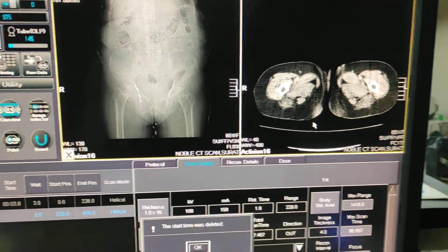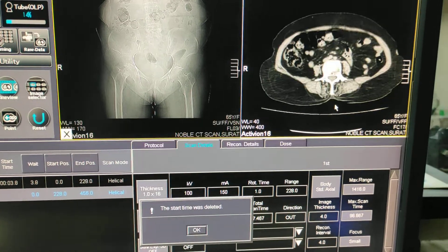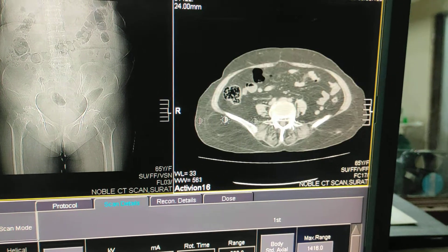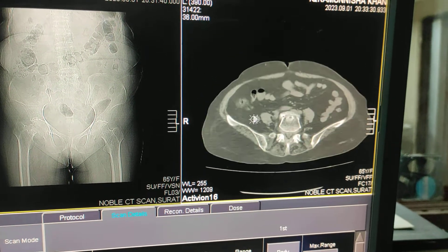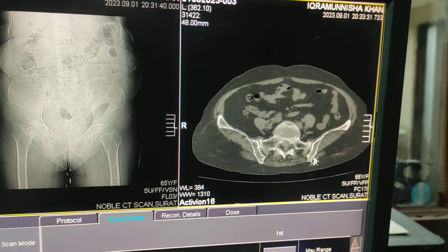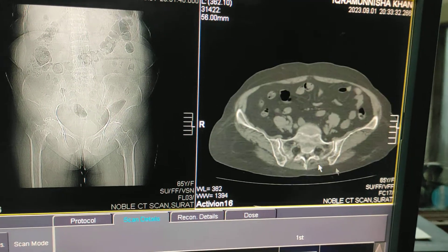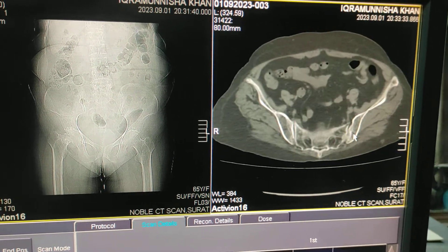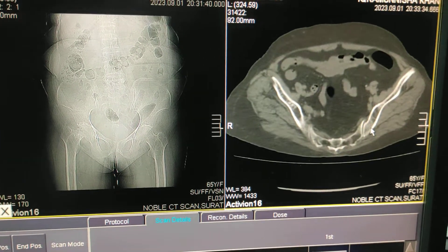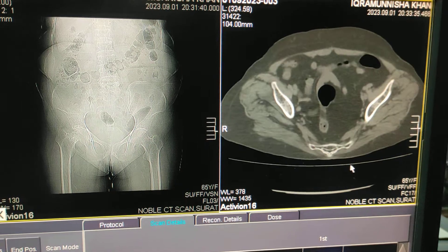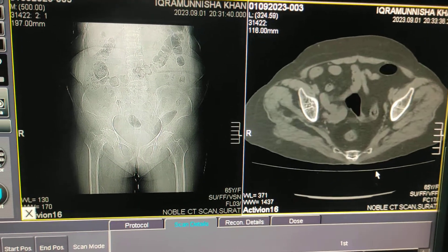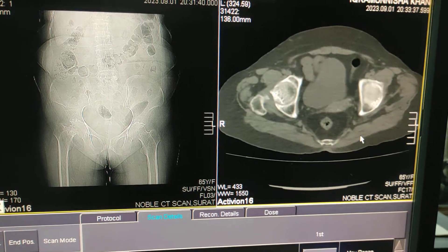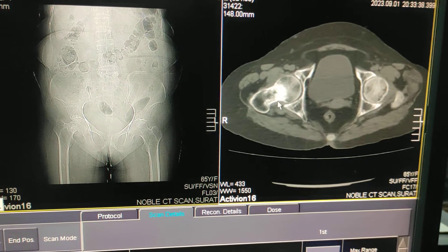I will show you the reconstructions for this patient. The patient has a complaint of trauma. Before removing the patient, you should check the images to see whether there is any motion or not. If the scan is proper and there is no motion, you can take the patient out. Here — there is a fracture in the neck of the femur.